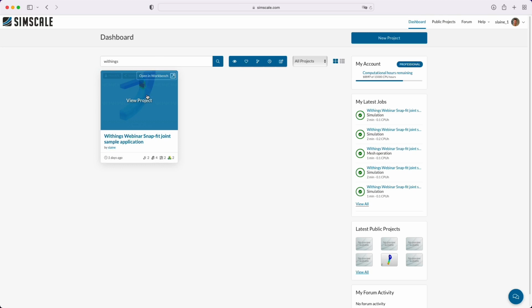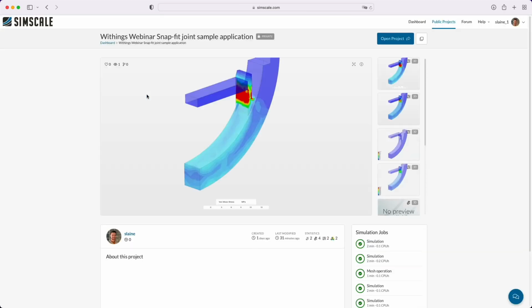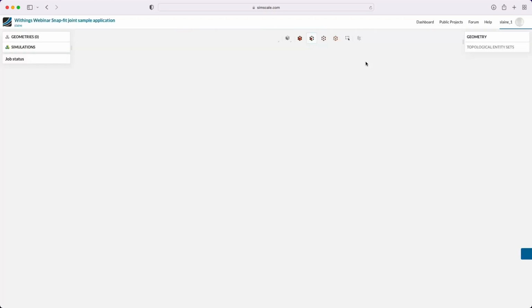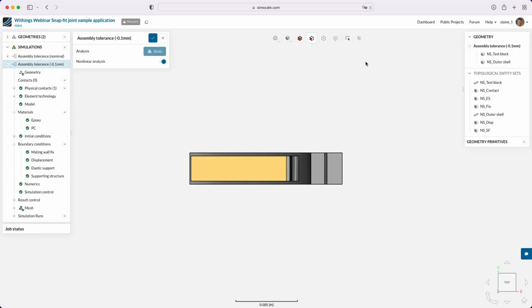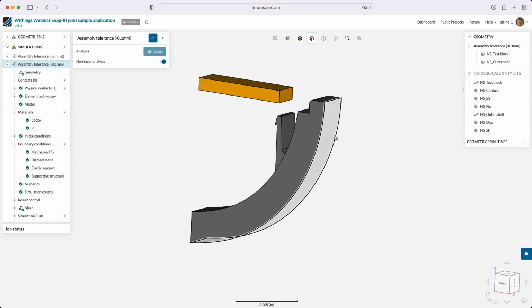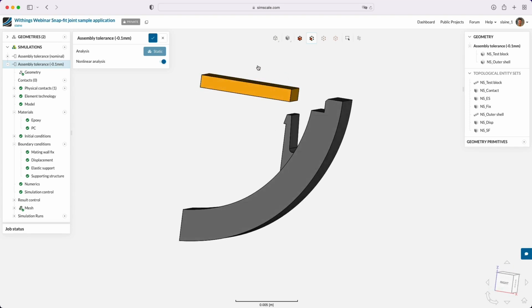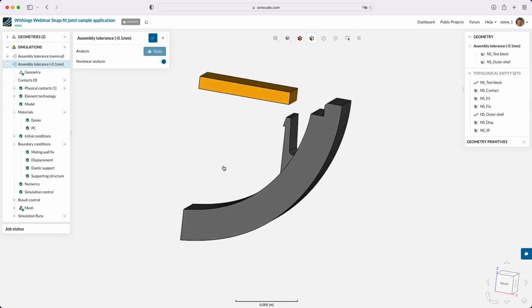So if we search for the project we're going to have a look at today, it's this snap fit from Withings. And we're going to have a look at some nonlinear FEA analysis of this snap fit. Okay, so as we introduced in the slides, we can see here the casing and the base and the snap fit connector, the single-use snap fit connector that holds all of this together.